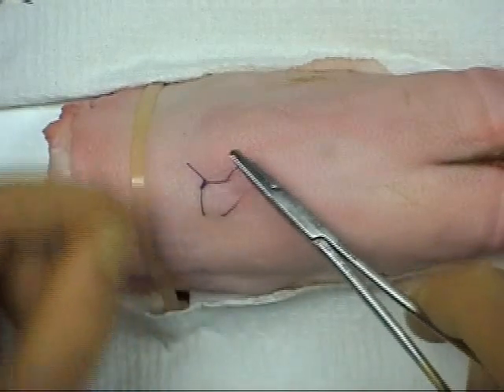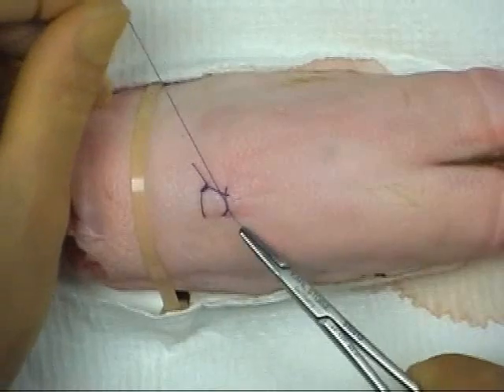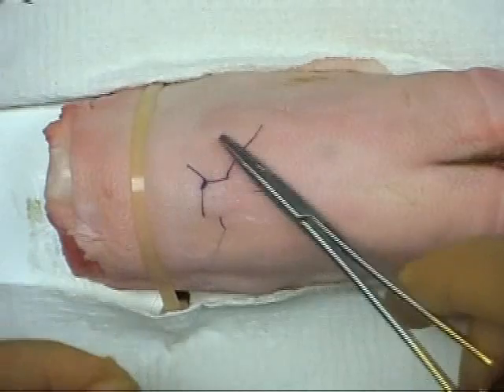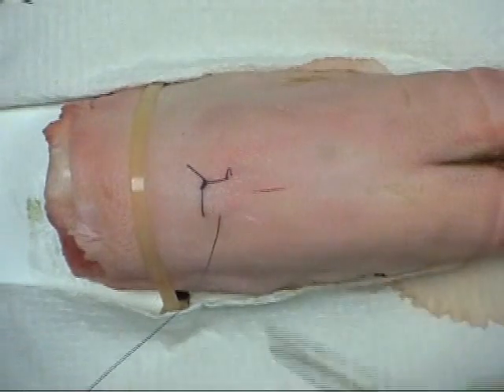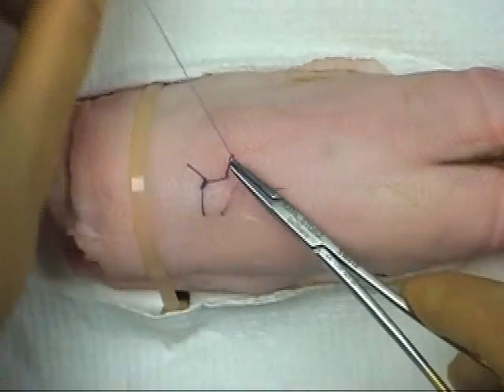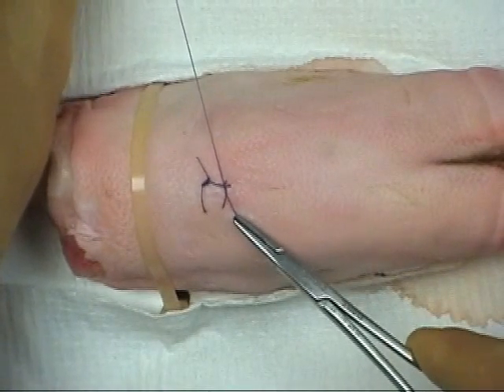Sometimes it is difficult to maintain tension with an initial single throw and the first hitch may become loose. In this case, a surgeon's knot can be formed. The first throw can be tightened down and then jammed over to the side to keep it in position while the next throw is being formed.